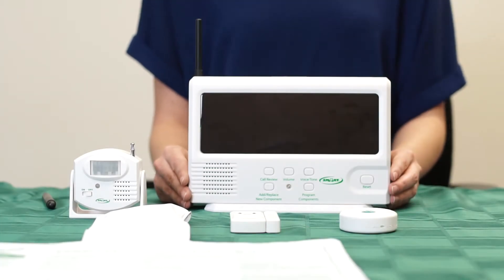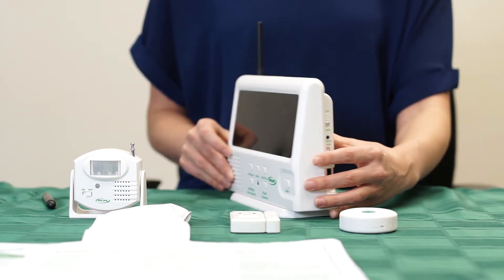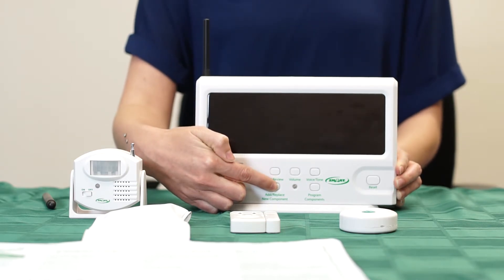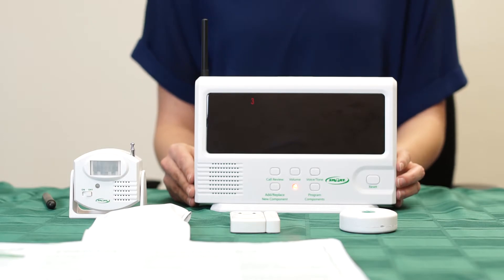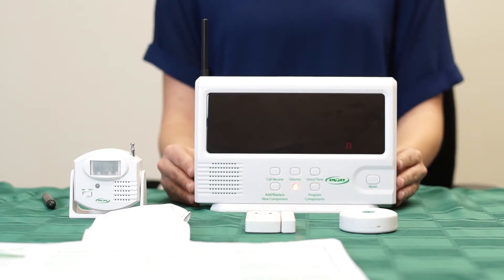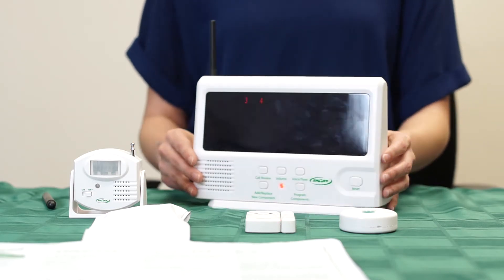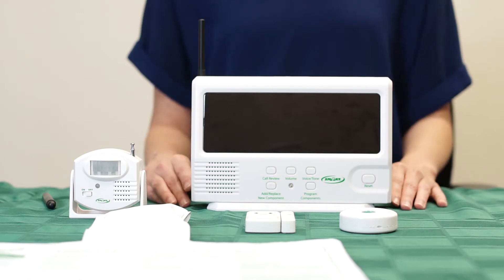To add components to a central monitor with previously programmed components, you must start by moving the lock/unlock switch to the unlock position. Press and hold the add/replace new components button for two beeps and a tone. Then quickly press and release the program components button once. The display will show you the number of the last component programmed into the central monitor. Wait until you hear a tone to let you know that you can begin programming. Activate the new component that you wish to program into the next available numbered position. Wait for the acceptance tone before programming the next component. Once done, move the lock/unlock switch to the lock position and press the reset button. Now you can test all of the components that you just added to your central monitor.